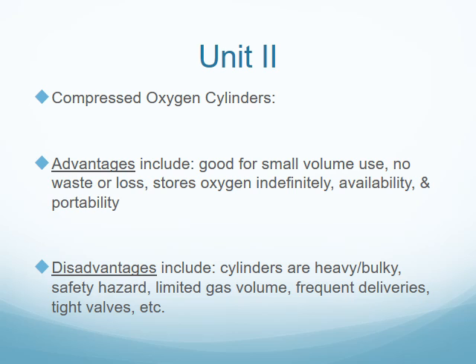So as I have stated previously, if a person was to go out and run errands, etc., they need to be able to calculate, or at least estimate, how much oxygen they will need for their trip. It requires frequent deliveries and tight valves, because it's only so much in the little cylinder, and you don't want to leave it running and have it seep out. So it's just a few things you need to think about, but this is a couple good listings of advantages and disadvantages to consider.